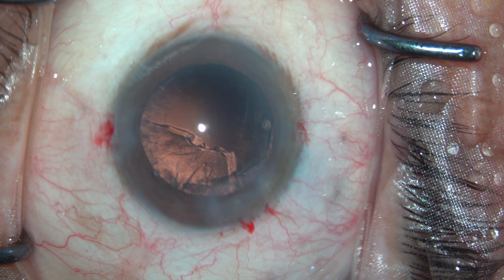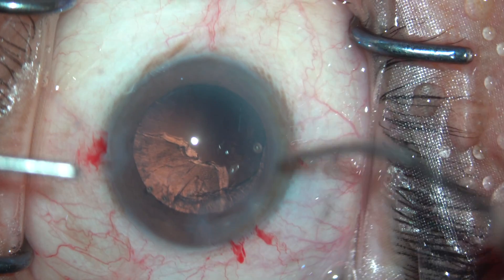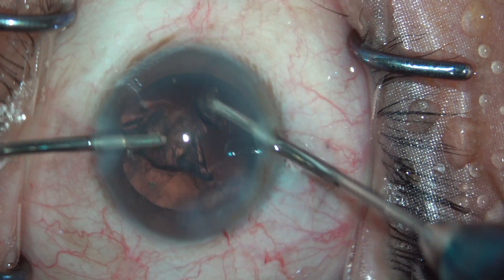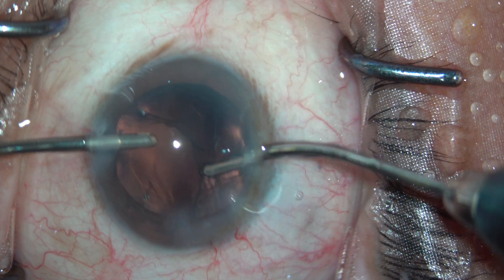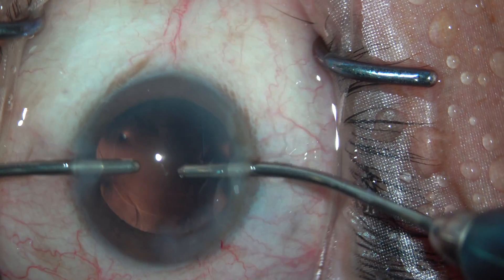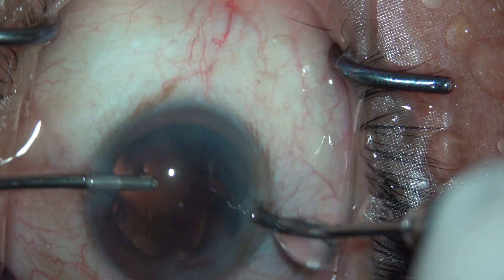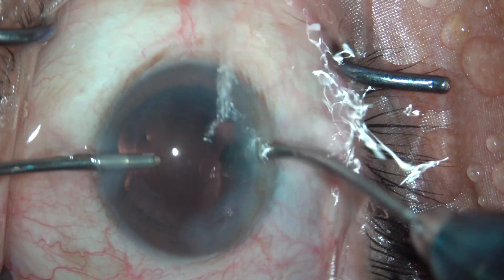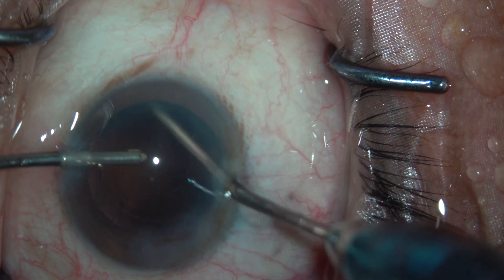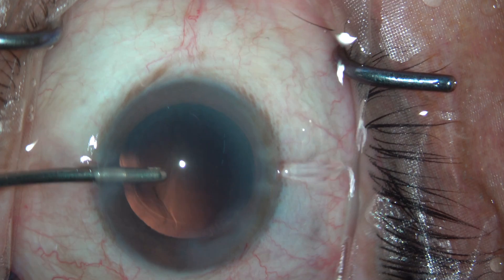The next step now would be doing an irrigation aspiration. I prefer to use a bimanual IA, going inside the eye and grabbing hold of the cortex chunk that is there, then bringing it to the center and aspirating. Then polishing the PC and the anterior capsular rim. I do spend a good amount of time in this step as I want to minimize my chances of having a PCO later on.